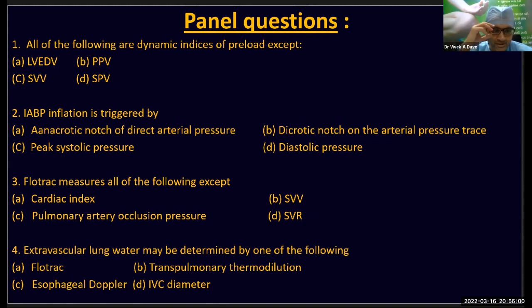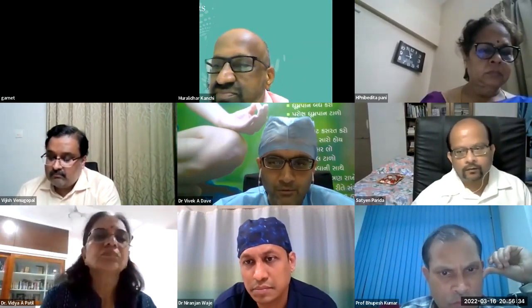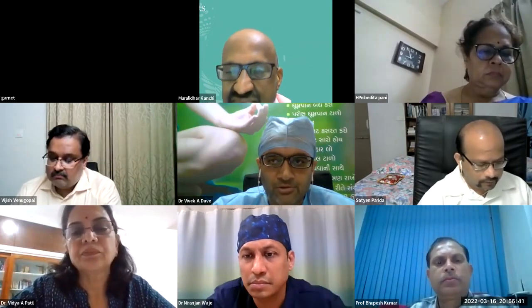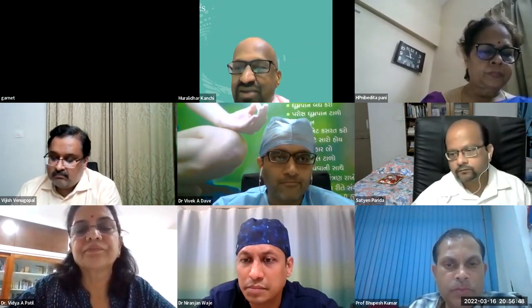Back to the question: extravascular lung water may be determined by one of the following four options. A, FloTrac; B, transpulmonary thermodilution; C, esophageal Doppler; and D, IVC diameter. Out of all, transpulmonary thermodilution is the very sensitive method to determine the extravascular lung water as compared to all of them. Other variables along with extravascular lung water, like global end diastolic volume, PVPI, and all these things are also measured by TPTD. So transpulmonary thermodilution is the sensitive method to determine extravascular lung water. Absolutely. Thank you, Vivek, for that.